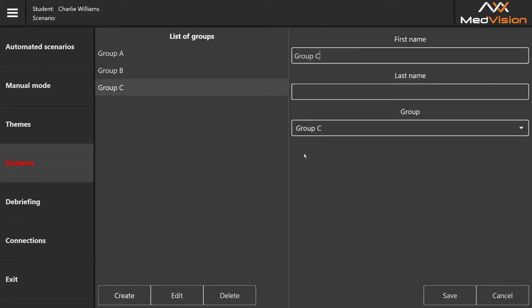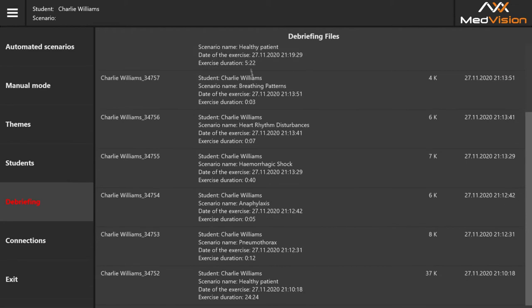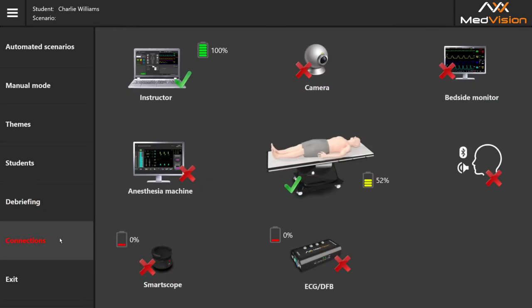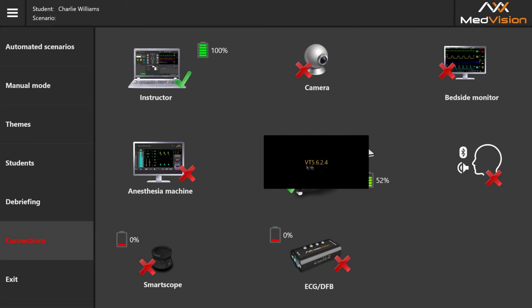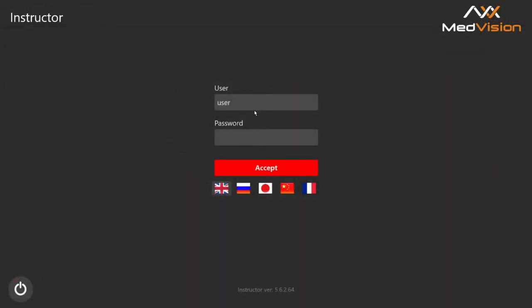You can go even further and specify group members, for example group C with John, Jenny, and Alex. In the debriefing tab you have debriefing files and a connections tab showing all elements of the system connected in real time, along with battery charge percentage. Pressing the patient icon shows the software version, and pressing exit takes you to the user selection screen where you can also choose different languages.